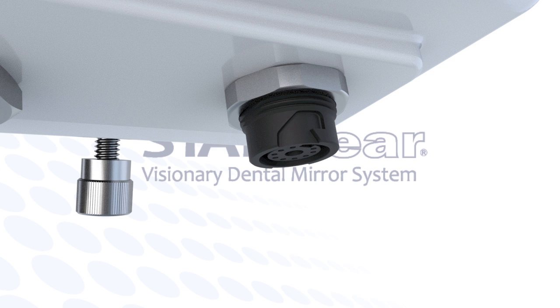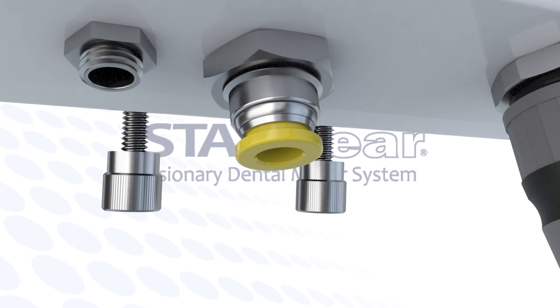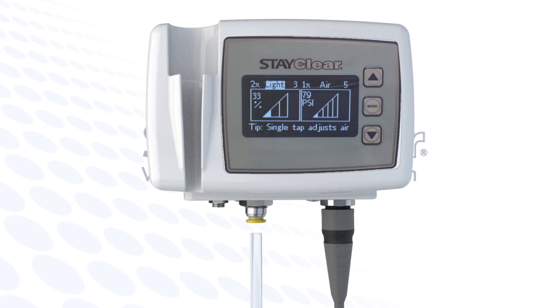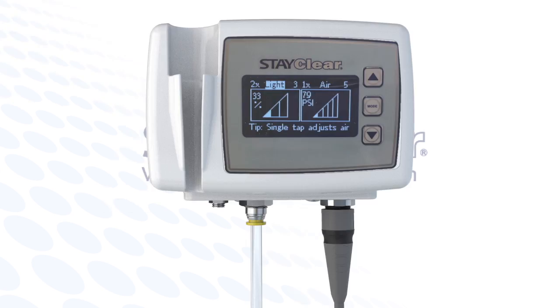The umbilical locks into the underside of the cradle system. Next, let's attach the clean air tube into the StayClear display cradle by pushing on the yellow ring on the bottom of the cradle and display unit and inserting the clean air tube into the cradle air inlet port. On the opposite end of the clean air tube, you will find a dental quick disconnect which you must only insert into your air inlet in your operatory air system.